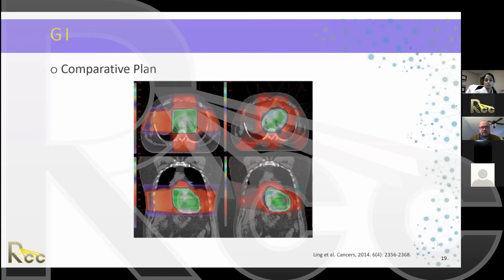So for esophageal cancer, it depends. At the center where I'm at, I practice in the community, and so we don't have 4D CT capabilities. Except I do have 4D cone beam CT, which is what I use for my lung SBRTs in some cases to assess motion. So given the limitations, I use the standard RTOG expansions, and I do obtain a daily cone beam CT on all of my patients. I treat them with free breathing, and because you use such large expansions, I don't think an ITV makes too much of a difference when treating these patients, because in general the volumes are so large and comprehensive.